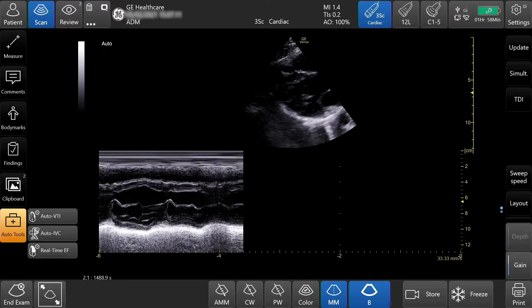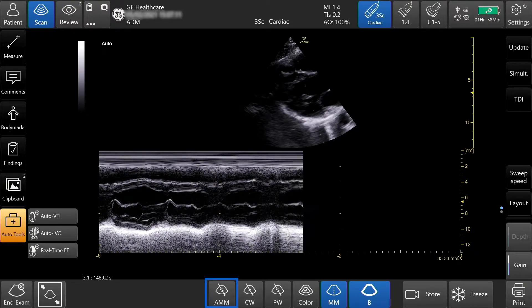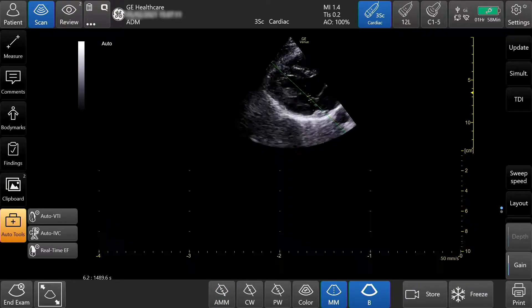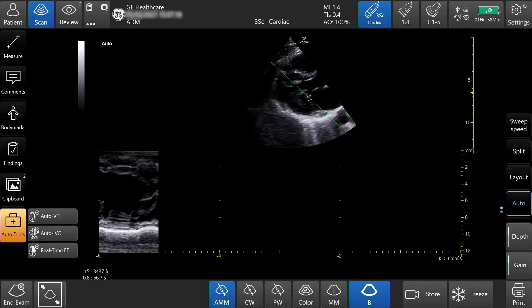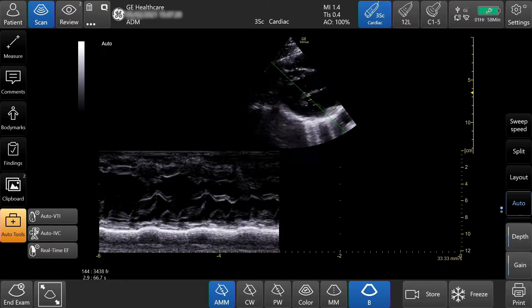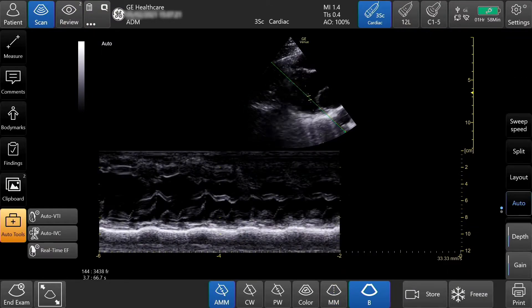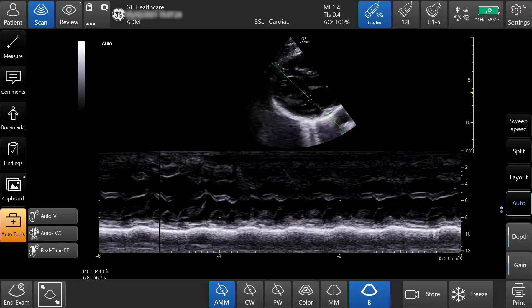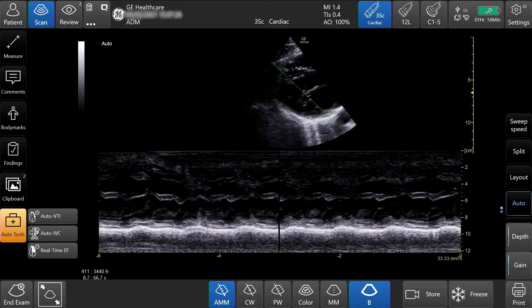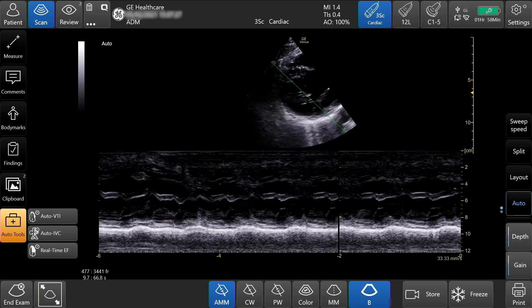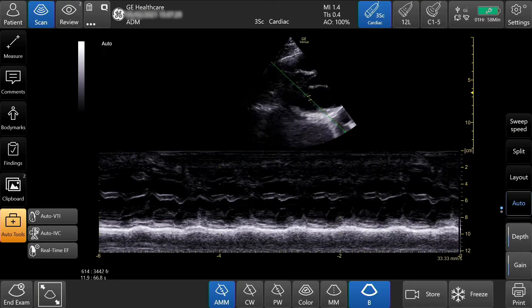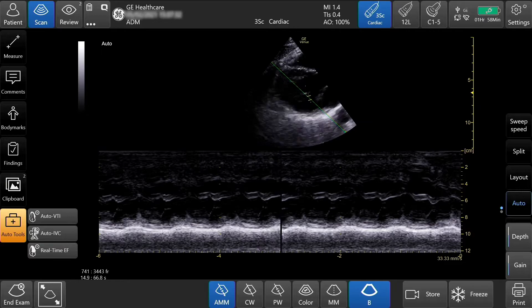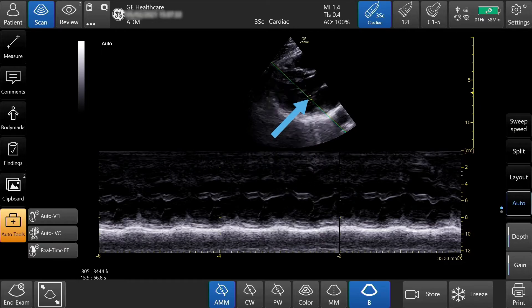To activate anatomical M mode, press AMM on the bottom of the screen. AMM is only available on cardiac applications and sector probes, and can be used on a live image or a stored video recording. AMM allows the ability to adjust the position and the angle of the M mode cursor.